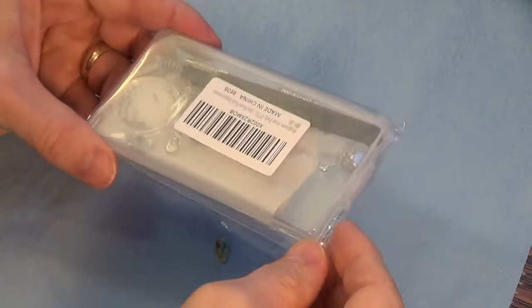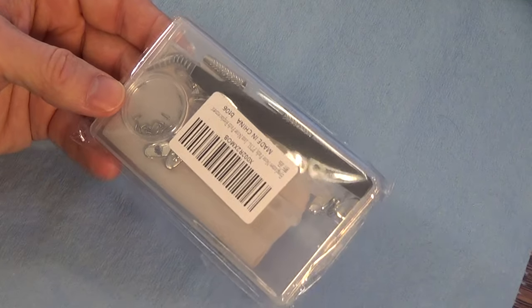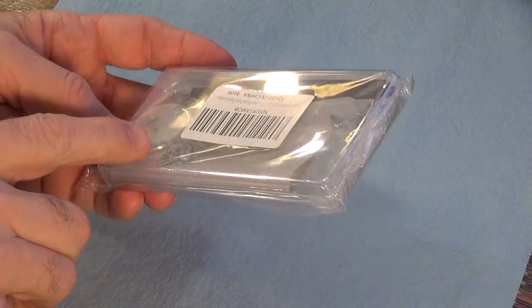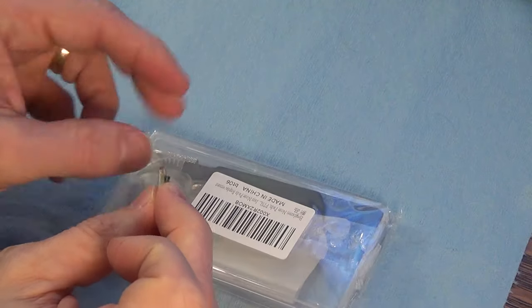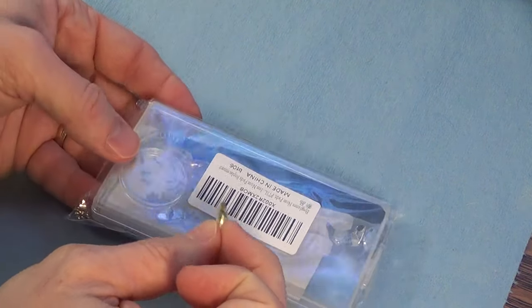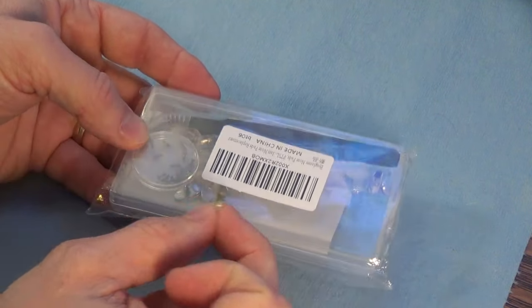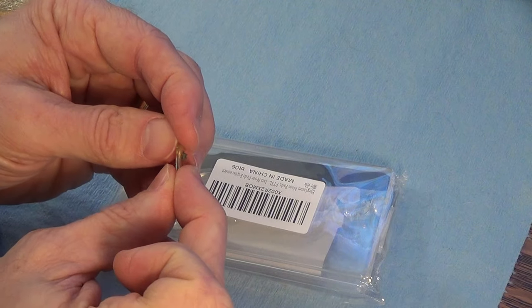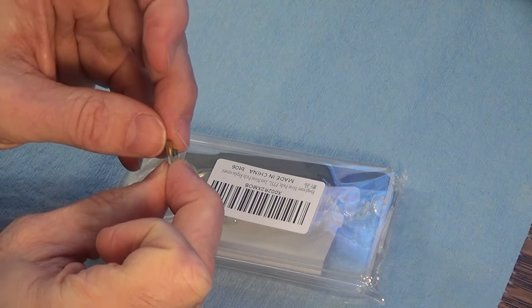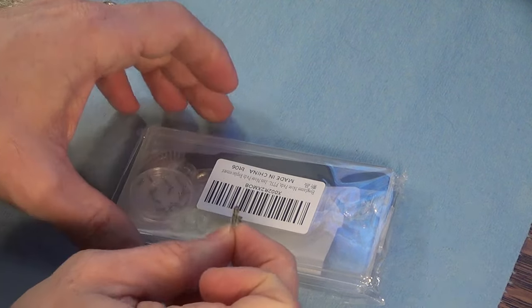I went on Amazon and searched for glasses nose pads. There's a variety you can order, but these had the right shape I was looking for and they had the rings. I found ones with rubber rings too, which are typically cheaper, but those don't hold or last as long. They tend to break off and don't allow that rocking motion as easily since the screw holds them more firmly.